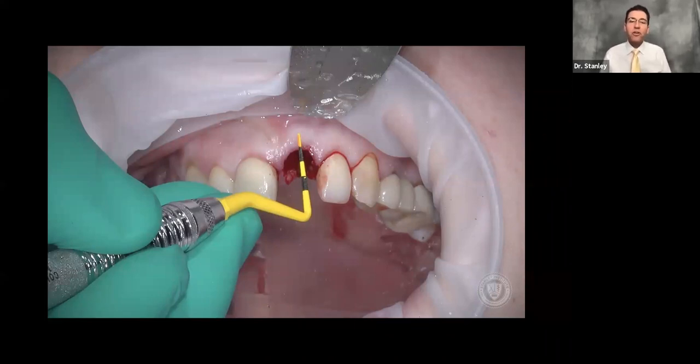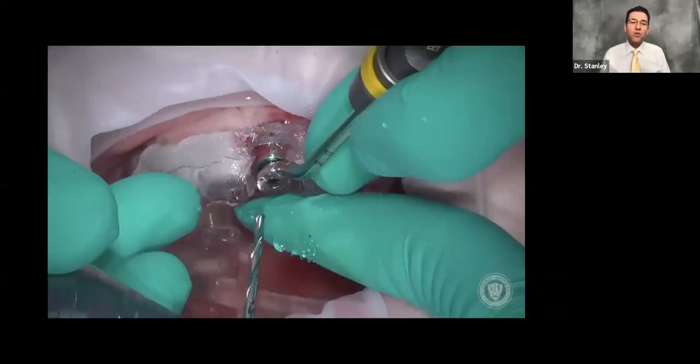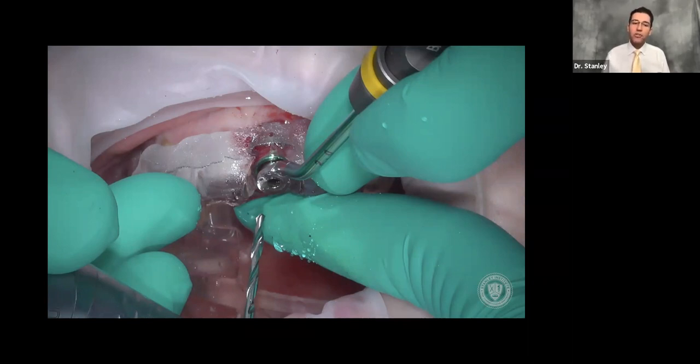We're within three millimeters, so we can proceed with the graft around our implant without a barrier membrane. The guide goes in — it's designed to have a stop position so the drill just goes down on the green guide sleeve all the way until it can't go further. Every one of the drills is the same length; we're only changing diameter. We step through 2.0, then 2.5, then 3.2. In this particular case, we're placing a 4.2 millimeter BioHorizons implant in the anterior, so we stop at the 3.2 — a whole millimeter below the final size — because we really want to make sure we get a little bite in the apical aspect.